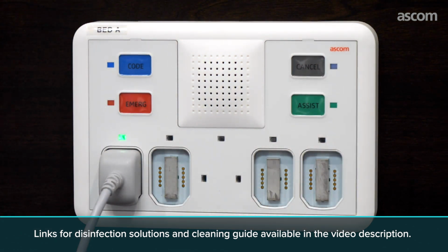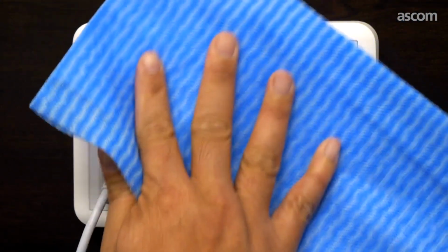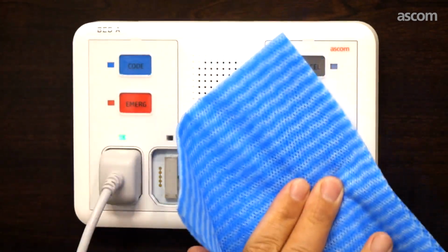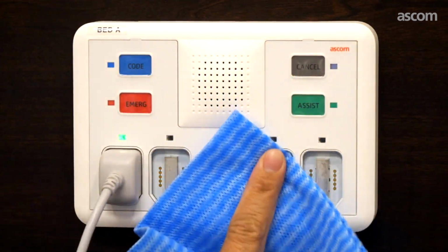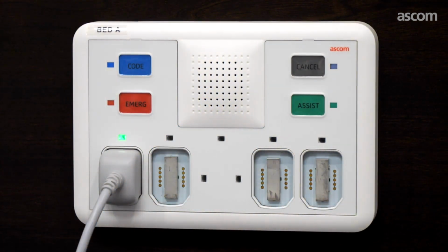Use another soft, dry cloth to wipe the station surface. It is especially important to dry the Safe Connect pins thoroughly. Third, the cleaning schedule. We recommend you clean the stations after every patient discharge, but as always, follow your hospital policies.